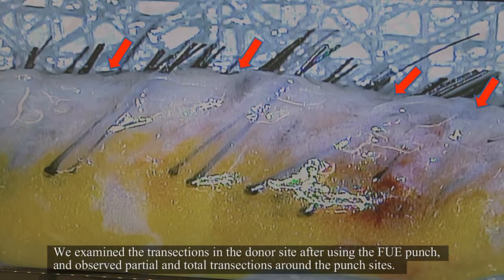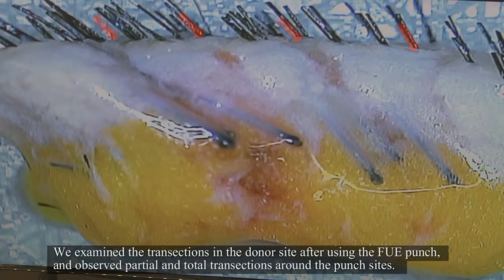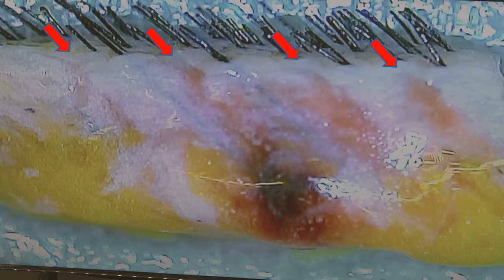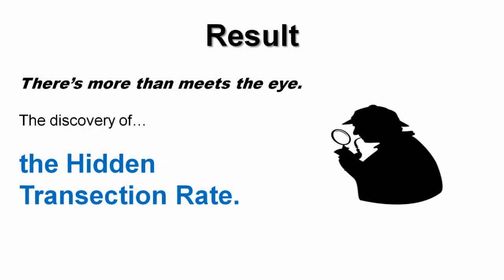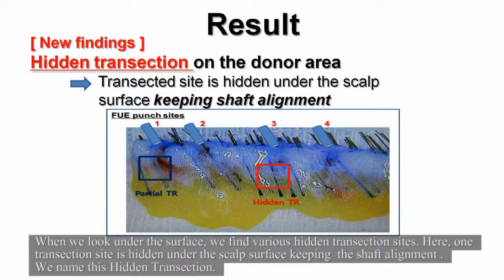We examined the transections in the donor site after using the FUE punch and observed partial and total transections around the punch sites. When we look under the surface, we find various hidden transection sites. Here, one transection site is hidden under the scalp surface, keeping the shaft alignment. We name this hidden transection.